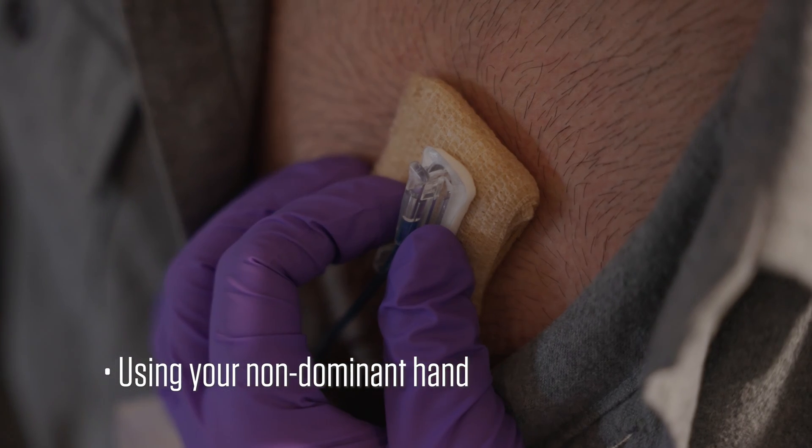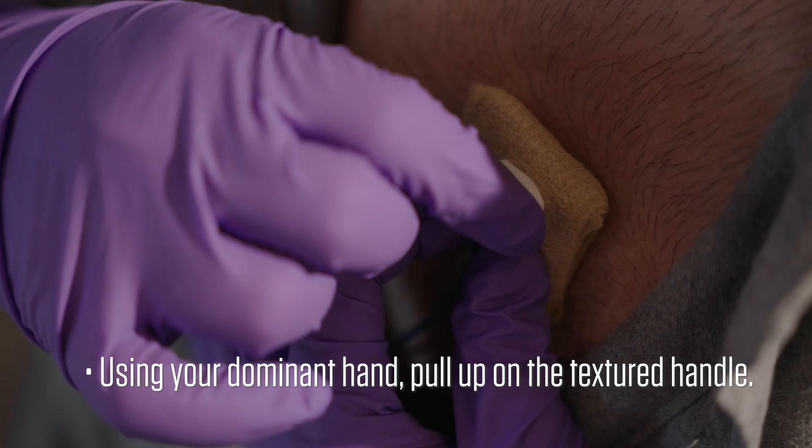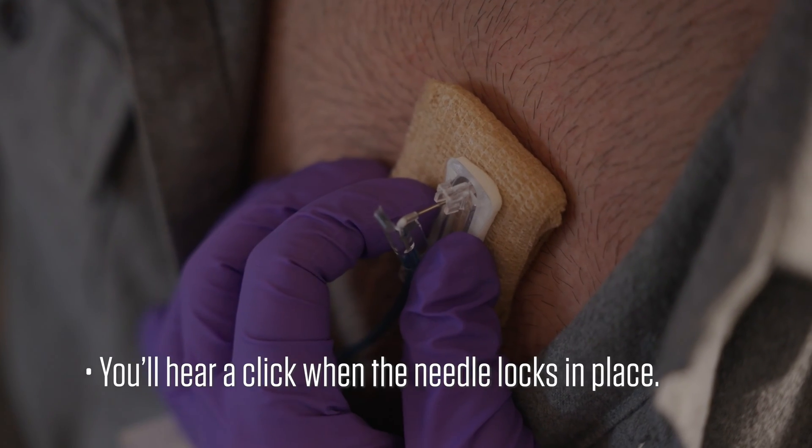Using your non-dominant hand, press the base of the port against your skin. Using your dominant hand, pull up on the textured handle. You'll hear a click when the needle locks in place.